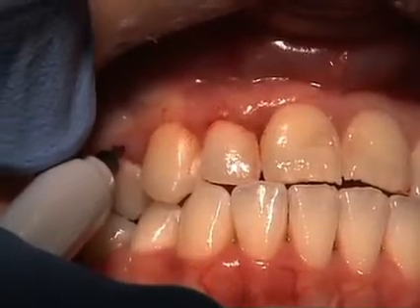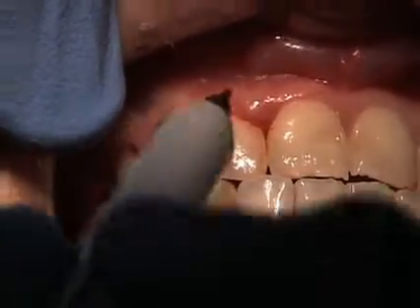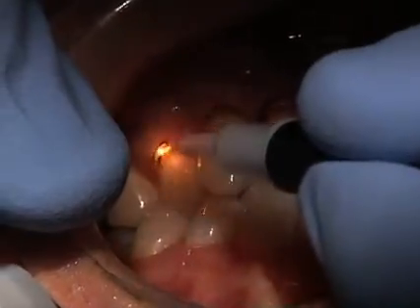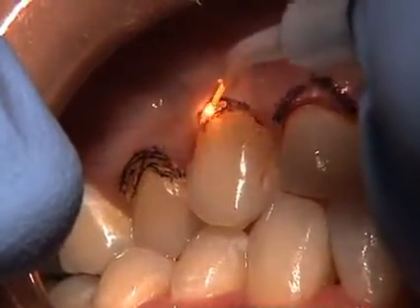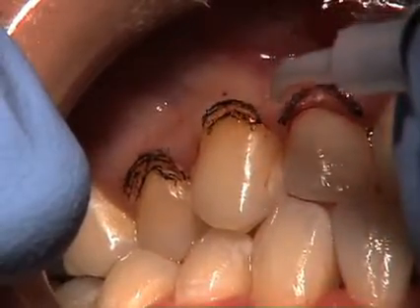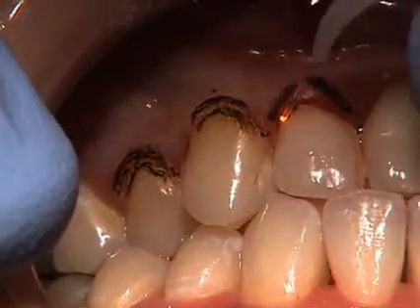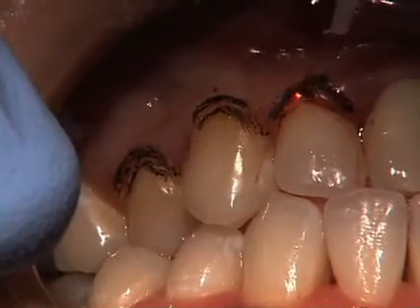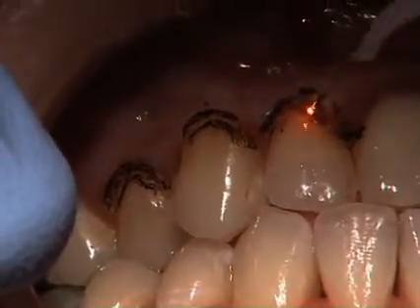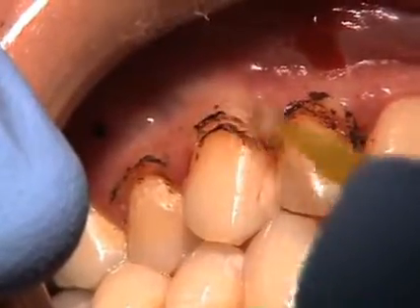What I like to do is mark the desired location of the tissue intraorally with a Sharpie. The technique is to use slow brush strokes without any pressure, walking across the area that we want to adjust until it's completely ablated. We're going to come back and rub off that ablated tissue in just a moment. If you have your power setting correct, you'll get good action on the tissue without any charring. Then we're going to remove the ablated tissue from the areas that we've adjusted.